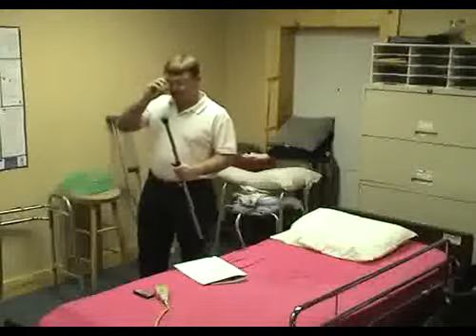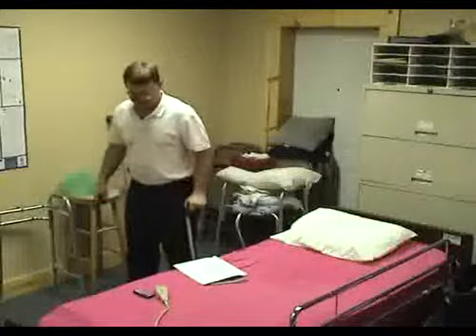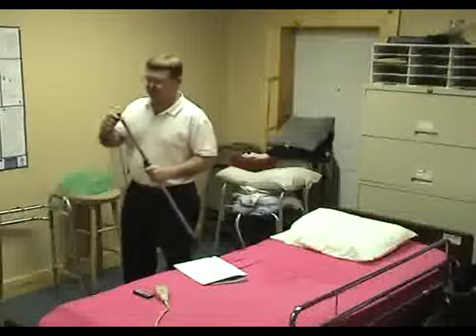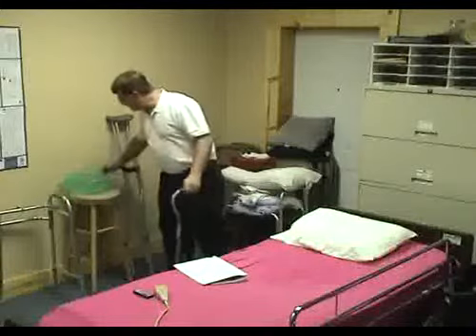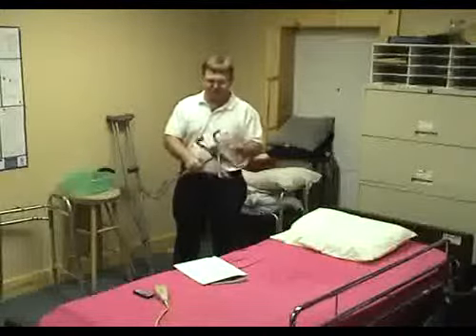I've seen a lot of these canes where this rubber thing comes off the end of it, and the patient loses it, but they're still using it. It's okay on carpet, but what's going to happen when they hit tile or hardwood? It's going to go straight out to the side. So make sure that rubber end's on the bottom. They sell these at the pharmacy. They're real cheap if you lose them. Like this one is missing two of them on the inside.